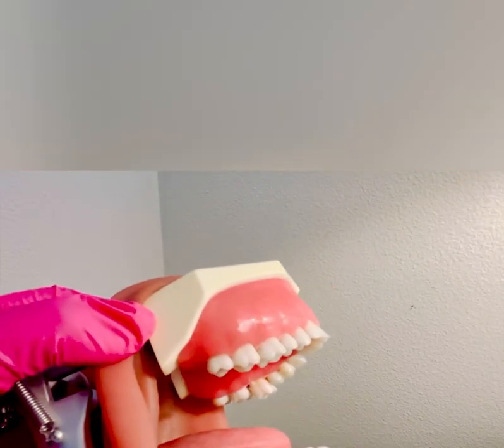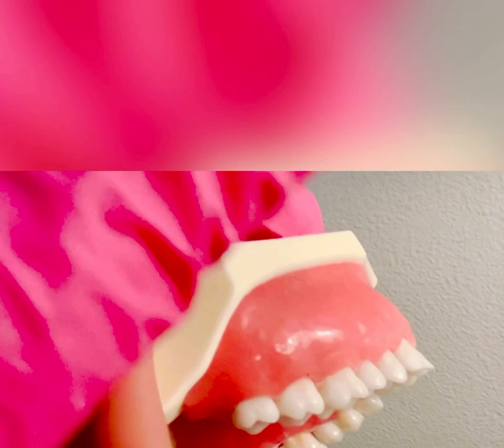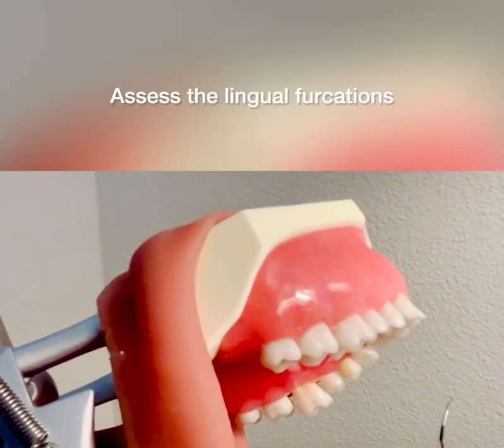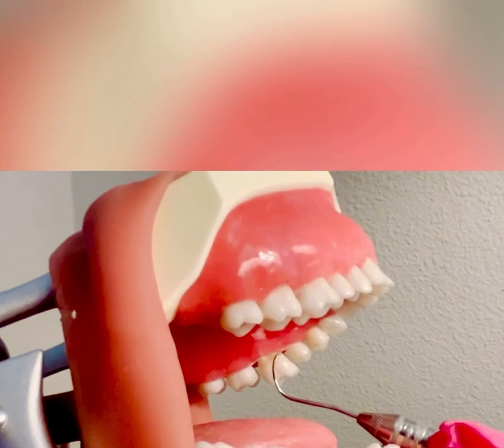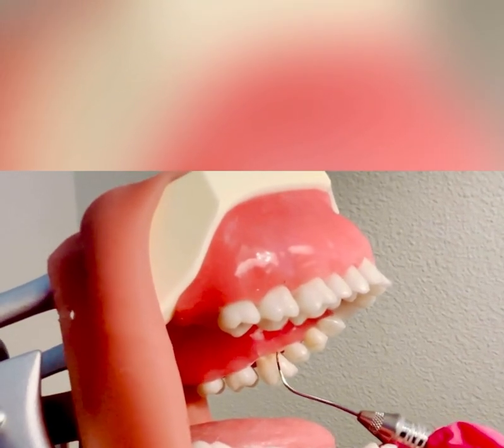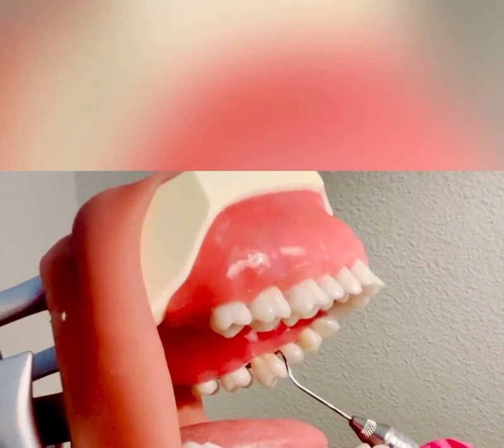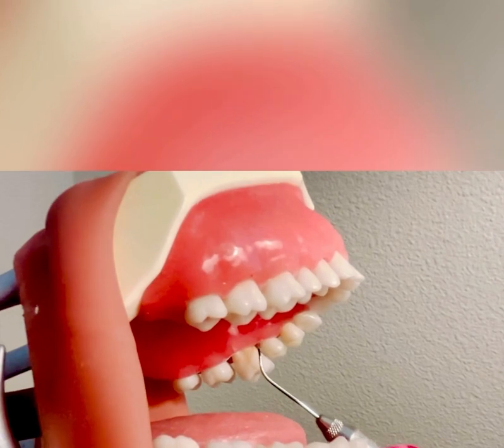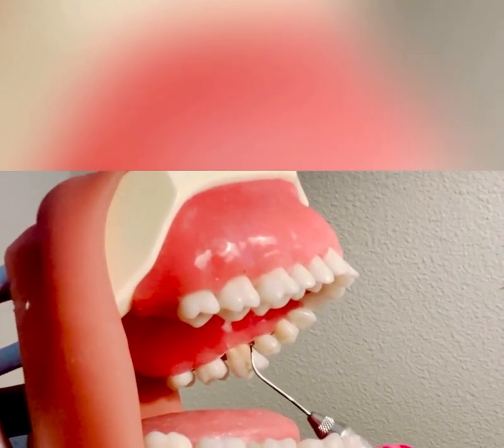On the lingual surface for maxillary molars, I'm going to assess tooth number 14. There is that palatal root, so you have to assess from the mesial line angle. You're going to do again an exploratory stroke — I have an extra oral fulcrum — wrapping and rolling right into that furcation onto the mesial. I can only go about one millimeter, so that is a grade one.